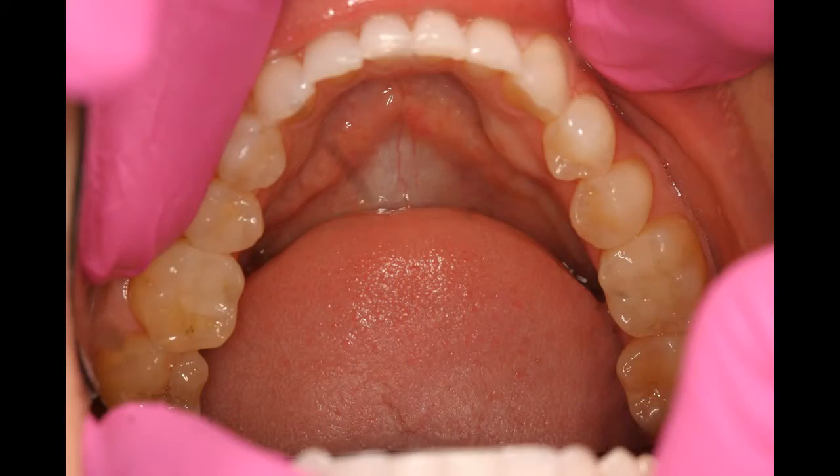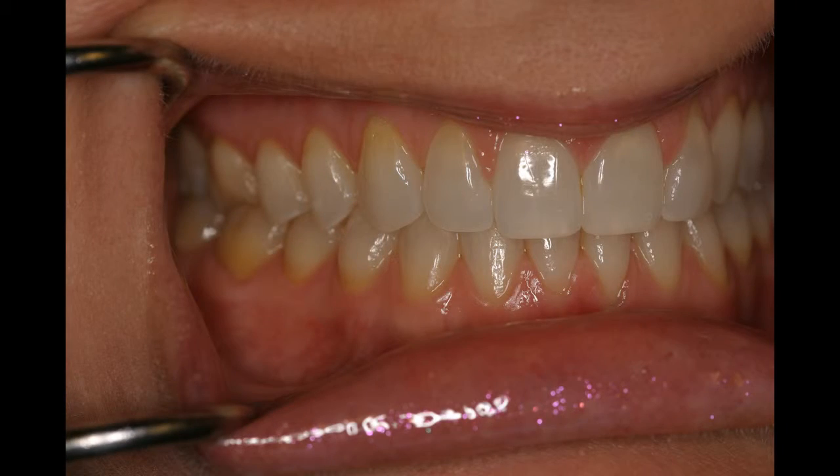The next 2 pictures, so numbers 3 and number 4, are occlusal shots, one of the maxillary arch, one of the mandibular arch. Easy pictures to take, a whole lot of information all at one time. You can zoom into any one quadrant pretty easily. You get it all on one picture of each arch. And then the final 2 pictures that we take are a retracted view where we're looking at a buccal shot, left side and right side. Same exact point for taking the occlusal shots. It's a lot of information and one image on the left and one more image on the right.